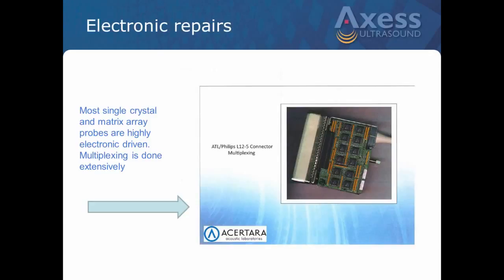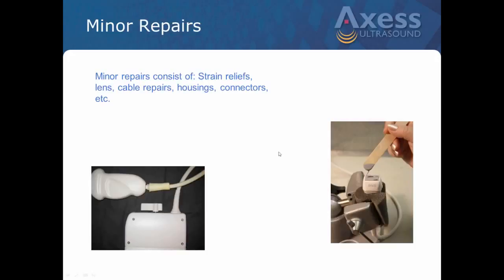And that's a fact. They do indeed, I've seen it with my own eyes many times, send you a brand new probe with a brand new machine, and if you thoroughly test it with some of these test devices, it will be bad. But yeah, Brian, it's really dependent on your installed base of probes. If you've got enough, again, I'd say 100 or above, you'll pay for this. You'll pay for this in no time.